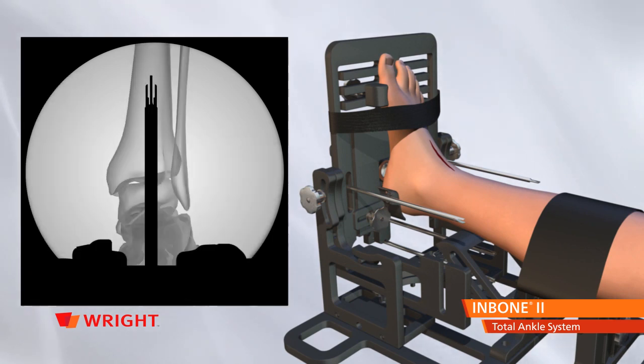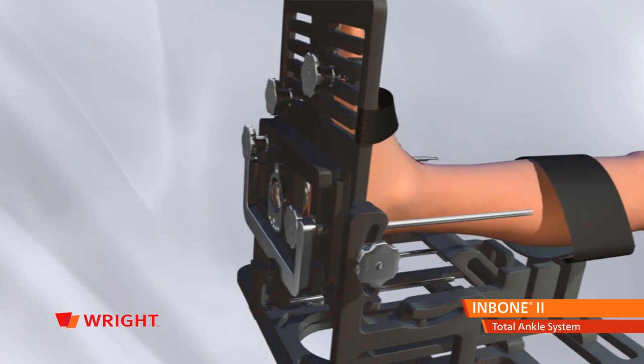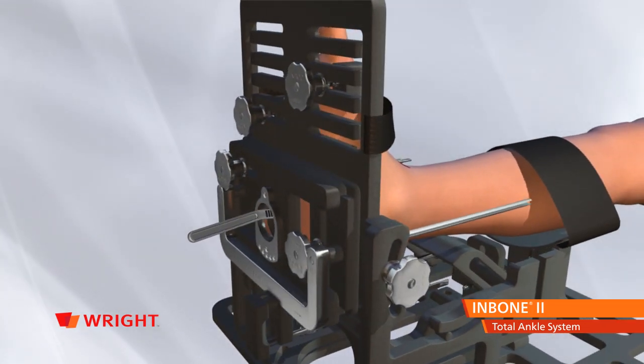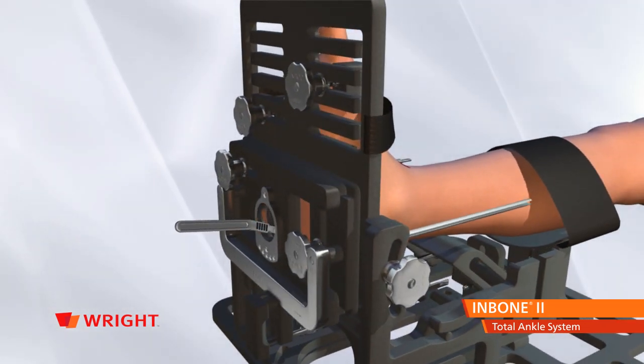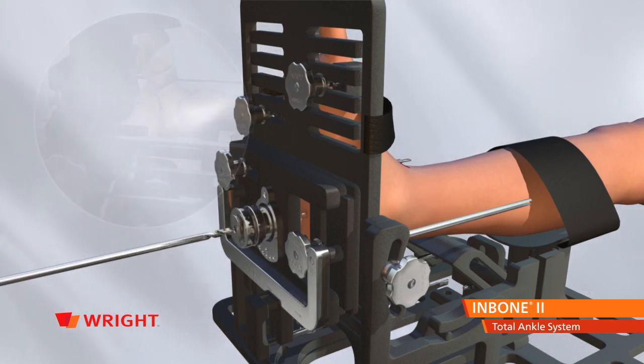Rotate the C-arm to AP view and confirm rod alignment. Make a vertical incision in the bottom of the heel approximately 15 millimeters long. Attach the primary bushing assembly and cannula to the foot holder and insert the 6 millimeter drill bit into the back of the cannula.